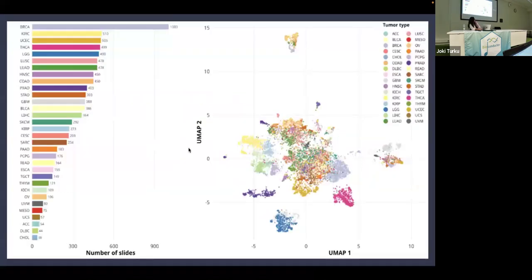And that was just interesting because we just computed the UMAP on all the images provided by the TCGA, and you can see they tend to cluster. And that's very interesting because what does it mean? That the different tumor types have similar information that Prov-GigaPath is able to detect. And then, yeah, now it's the time to go more into these results and try to understand more biology.